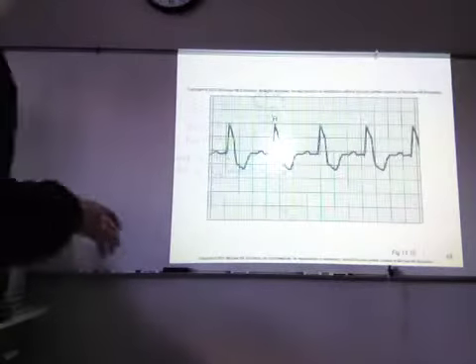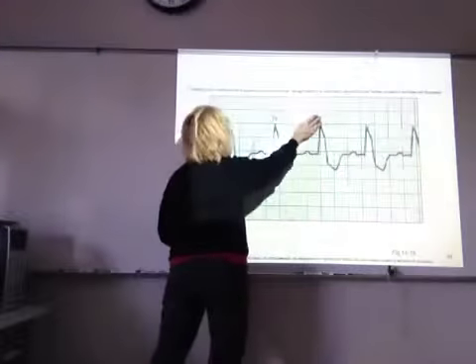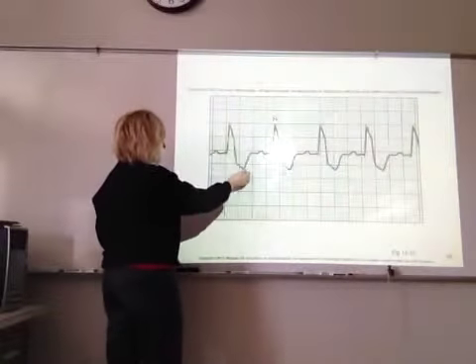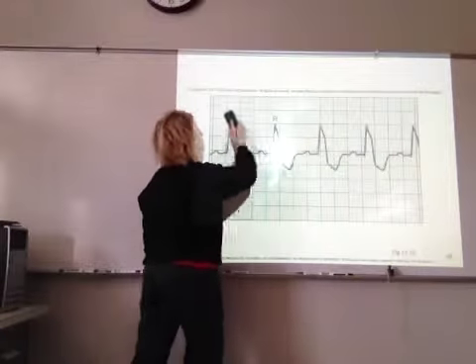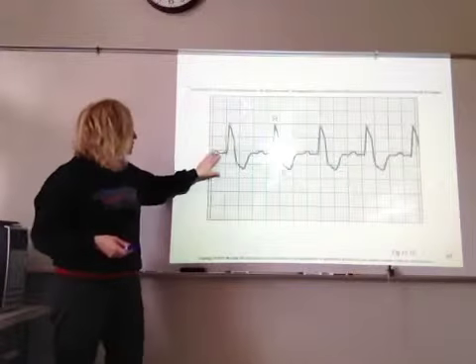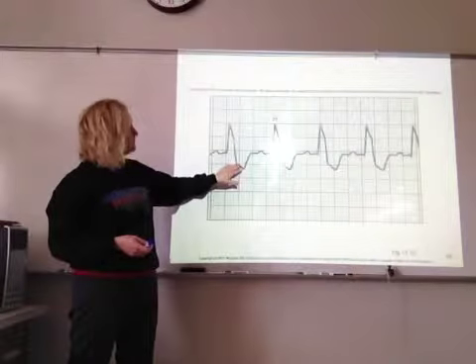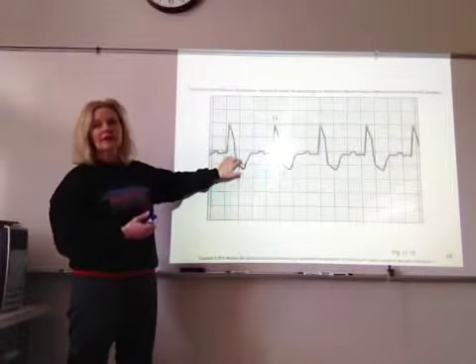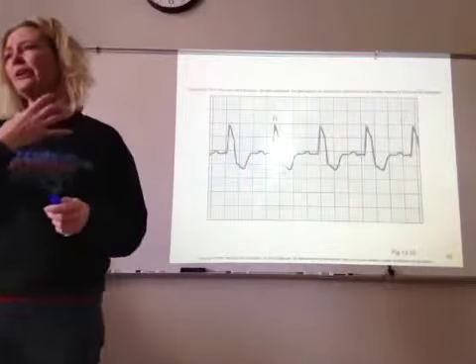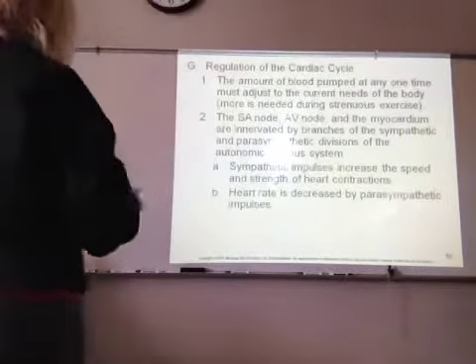And here you can just see how you can read an EKG. Notice how this one doesn't look quite so nice. This one drops down further. This would be an example of an abnormal EKG. Here I have a drop, so it could deal with something with the firing in your ventricle. Obviously this is dealing more with your ventricle than your atrium. Some people will have their heart tilted to the side a little bit, and that will affect their EKG.